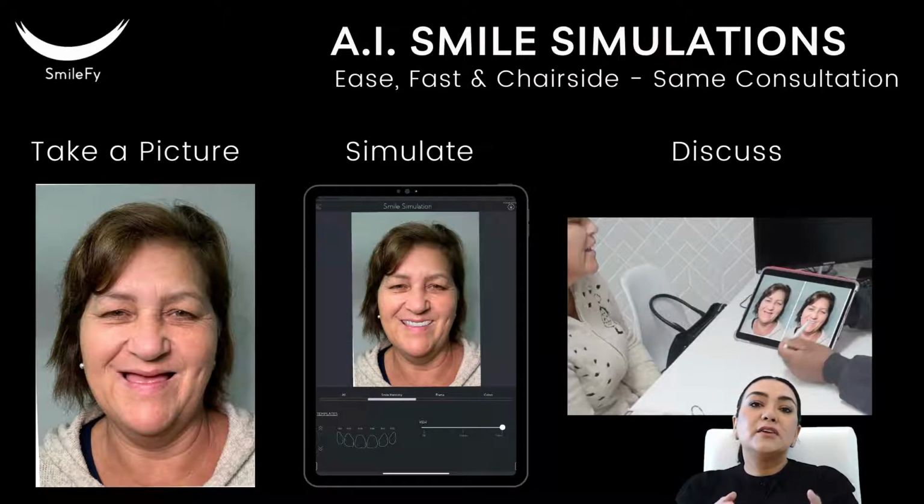The patient can give you information about the size of the teeth they want to have, the color, if they like that smile, seeing in their own pictures. So that's the thing. When we understand what the patient is looking for and we align the patient expectations with our clinical knowledge, the negotiation that comes out of this is easier only because you pay attention to all details that the patient gave to you.